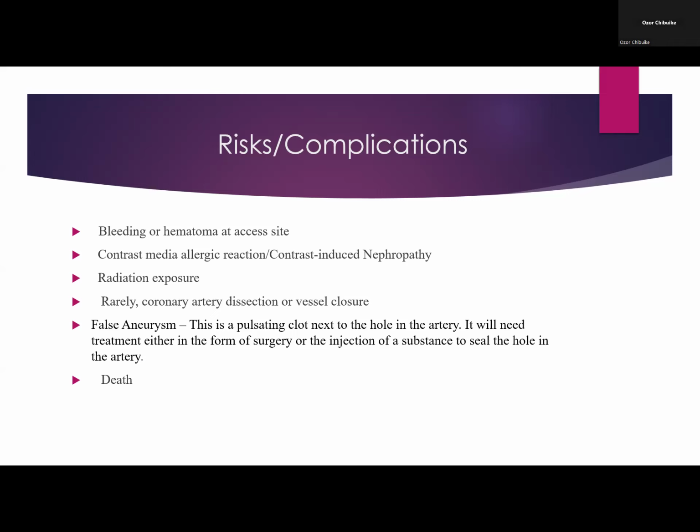And you also have the false aneurysm, which is a pulsating clot next to the hole in the artery, which would require either surgical treatment or injection of a substance to close it. Now, that could be a complication of the procedure. However, the risk of death is attributed to severe or acute illnesses that were not really well taken care of pre-operatively, and it is said to be about 1 in 1,000. So it's actually very, very minimal. However, it is less now because of advances in the procedure.